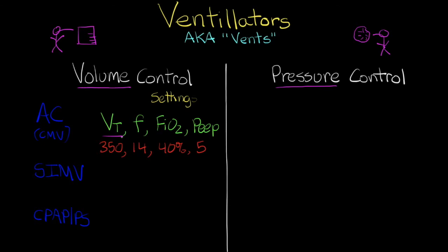Like I said, sometimes you'll see some variation in this from breath to breath, as well as long term. If we look at very compliant lungs, it's not going to take a whole lot of pressure to fill those lungs up with the volume that we want, as opposed to a stiffer set of lungs, which aren't as flexible. It's now going to require more pressure to push and expand and open up the lungs and the alveoli in order to deliver the volume of air that we want to give them.